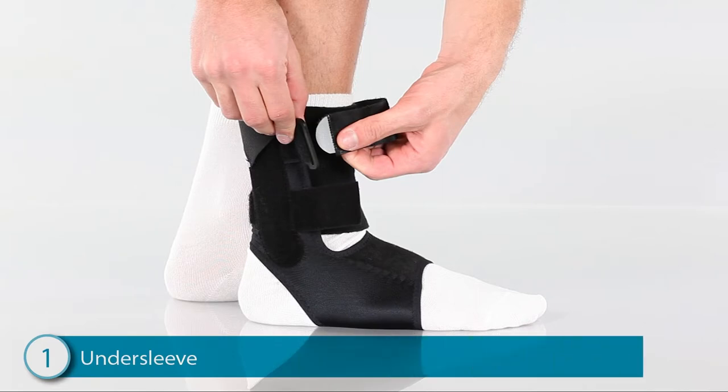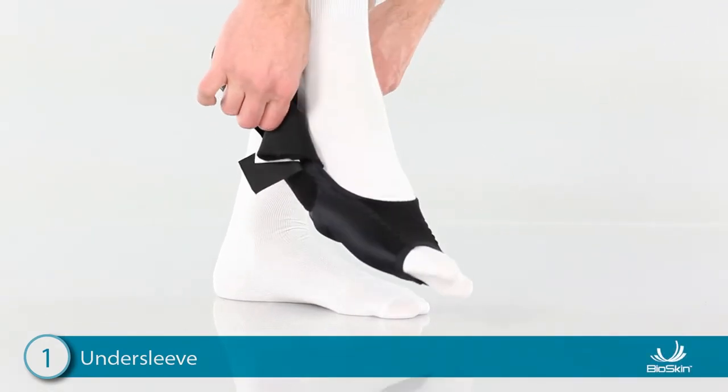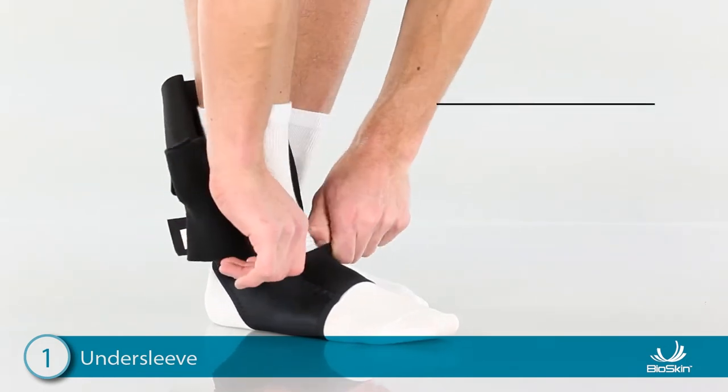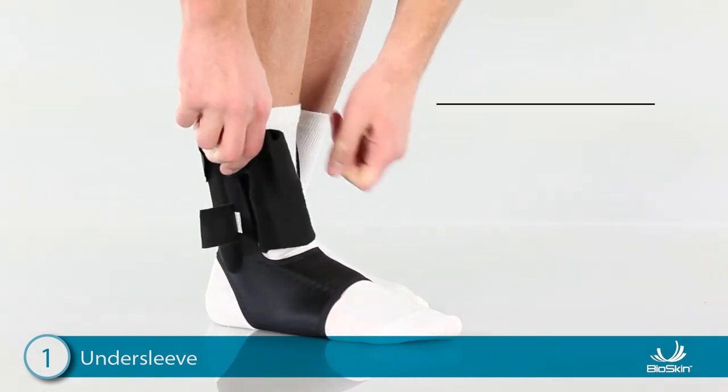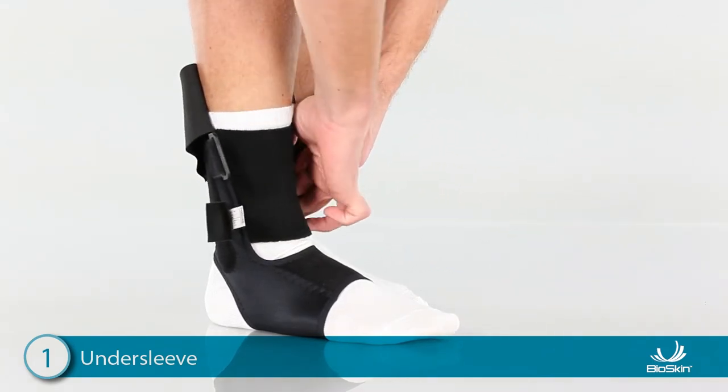Step 1: Applying the Undersleeve. To begin, pull the undersleeve over the foot with or without a sock and pull up tight. Next, locate the fleece flap, wrap it around the ankle, and tuck it into the brace.